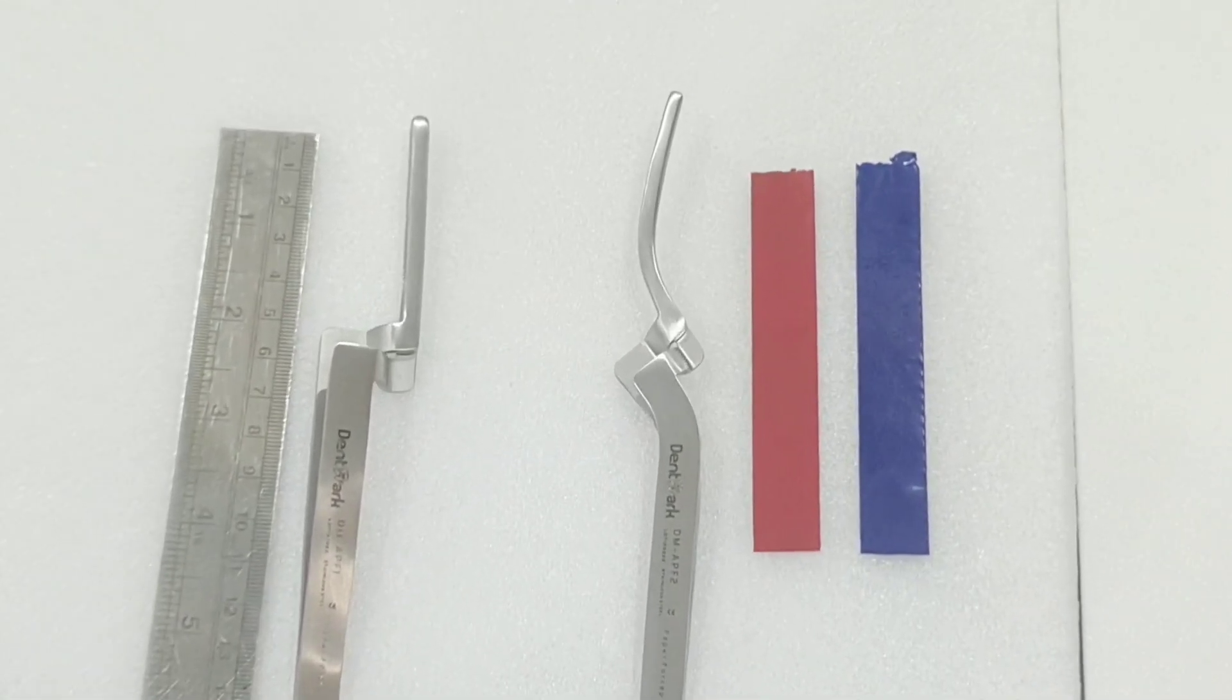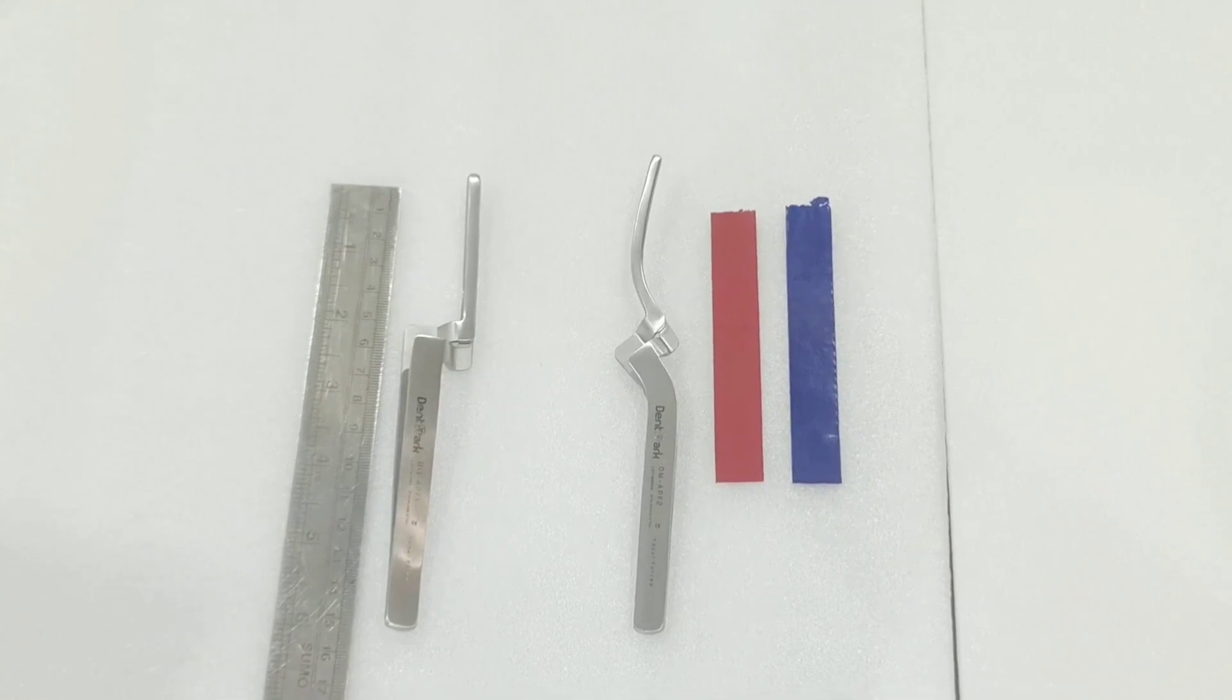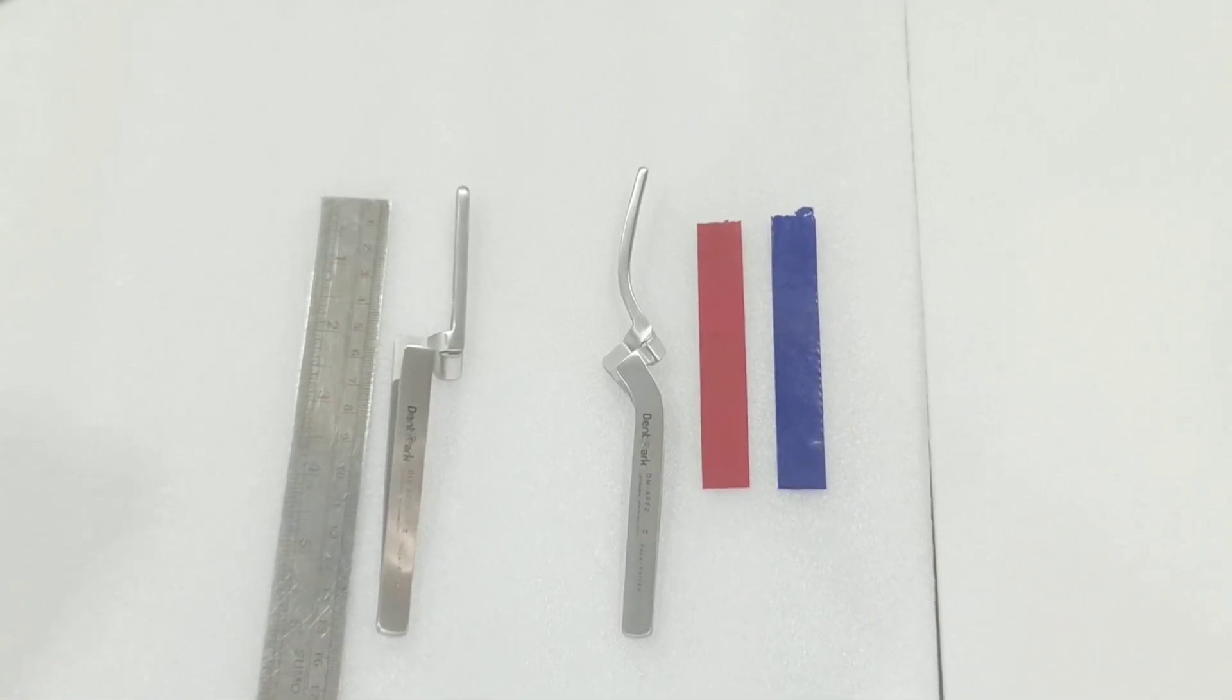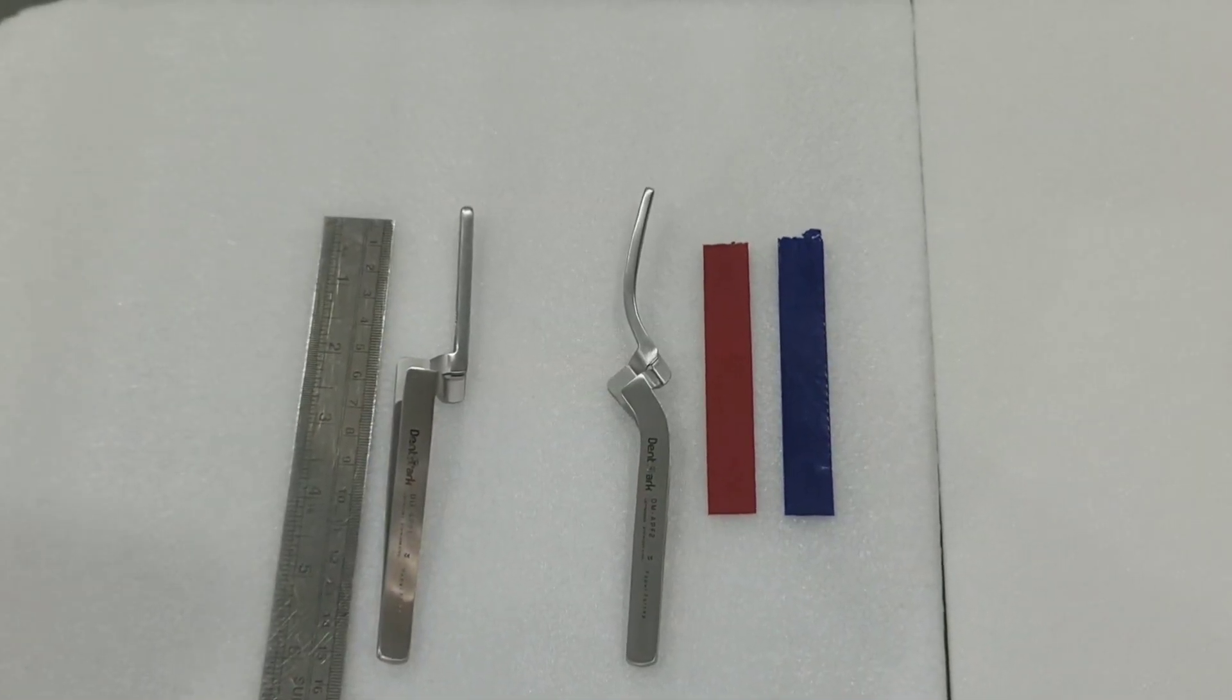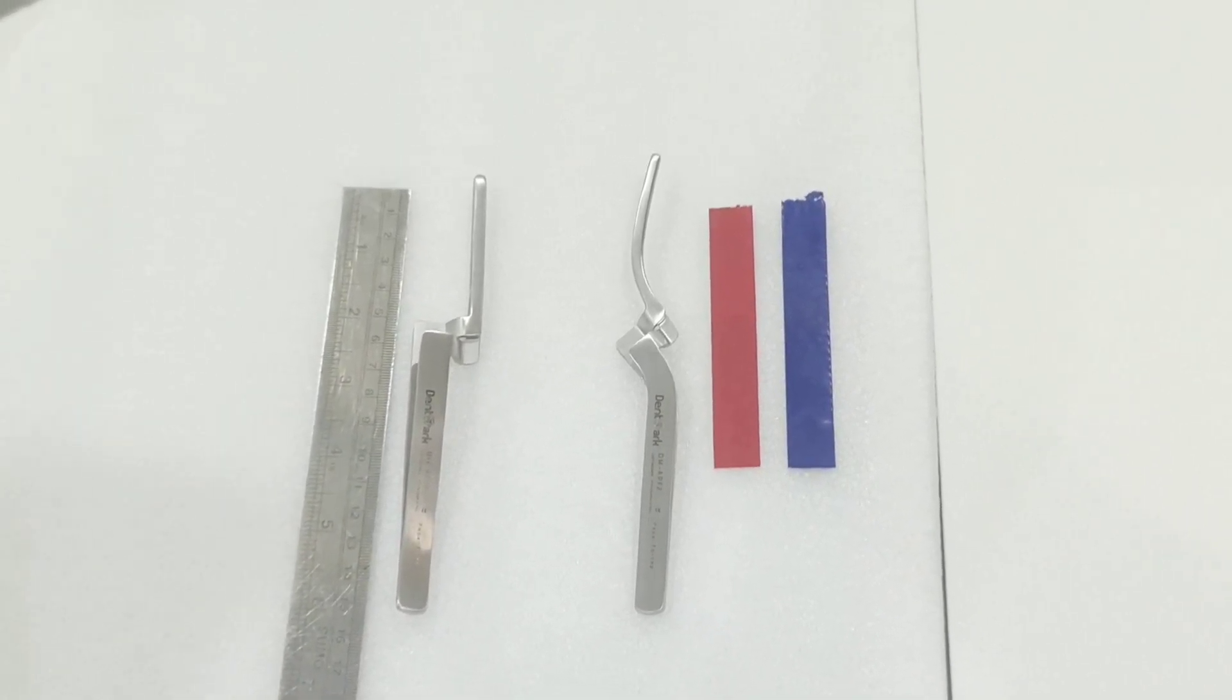This is another video from Denmark High Quality Dental Instruments. This is an articulating paper holder or forceps, used for checking occlusion of dental restoration and teeth. Holding the paper with an instrument rather than fingers assures better results.